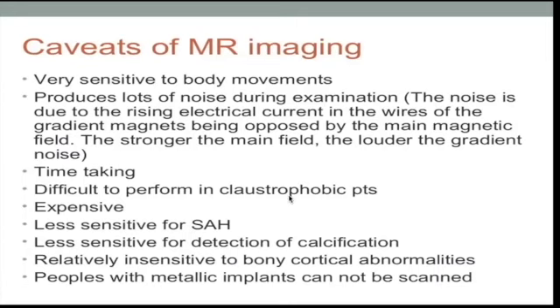It's difficult to perform if a patient is claustrophobic. Now, imagine if someone is afraid of being in confined spaces, and we put them in the MRI machine, which is just like being put in a tomb. It's just like any claustrophobic patient's nightmare. We put them there and ask them not to move, and they're going to hear very loud noises. So usually if a patient is claustrophobic and not sedated, I don't think you can ever get an MRI image from them. It's very expensive and it takes a lot of time.